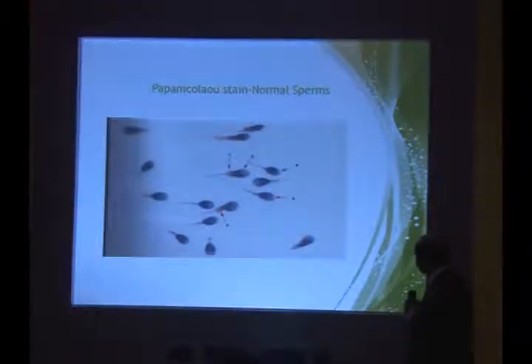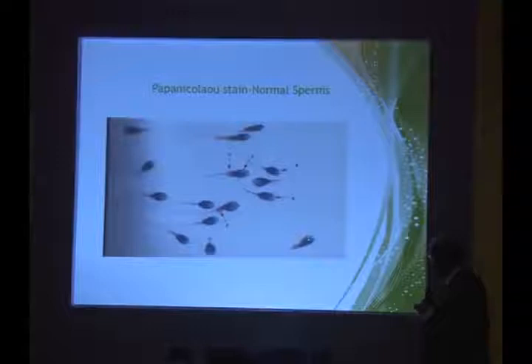Now this is a sperm which is not perfectly oval, so this is not classified as normal. It has a 30% acrosome, but this is a pear-shaped sperm. This has a large cytoplasmic projection and a reduced acrosome. A sperm with hardly 10% area which is acrosomal. A normal sperm, a perfectly normal sperm.